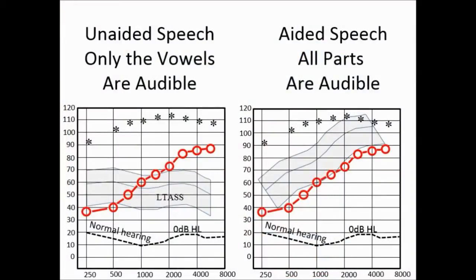You'll pick up a little bit less low pitch, because a lot of noise is hubbub, babble, blah blah blah, that's usually low pitched traffic noise, whereas the high pitched consonants, the letter S, F, TH, are soft and high pitched. They're also fragile, so they are easily masked or covered by low pitches. So you want to amplify treble more in noise and amplify bass less in noise.